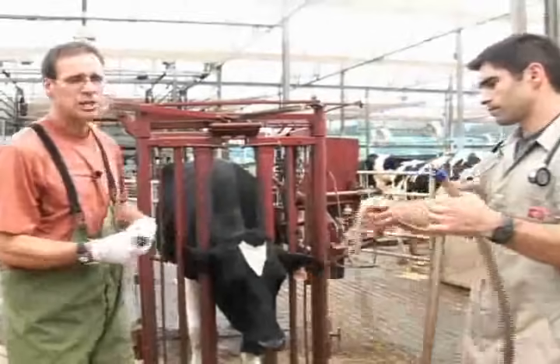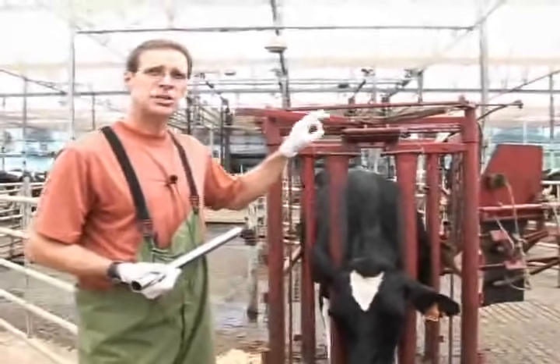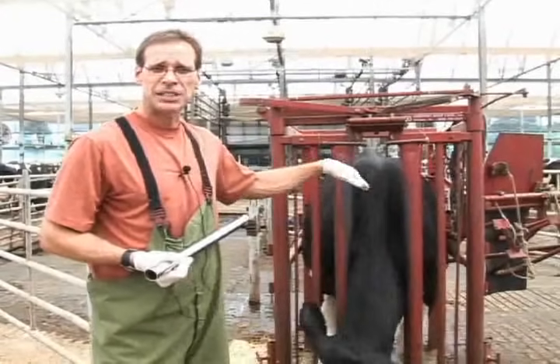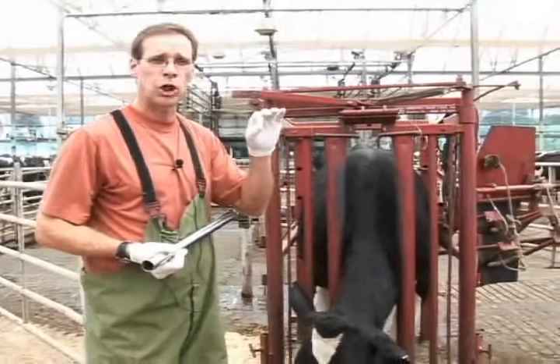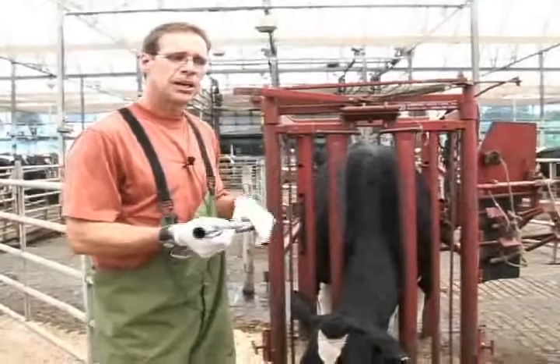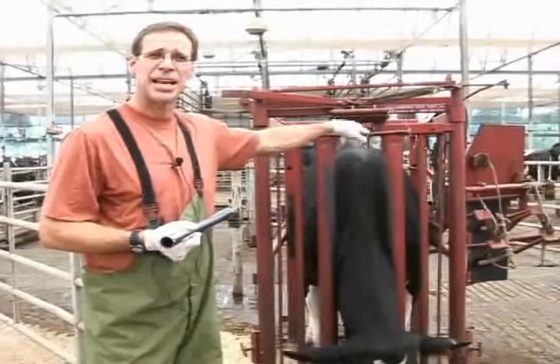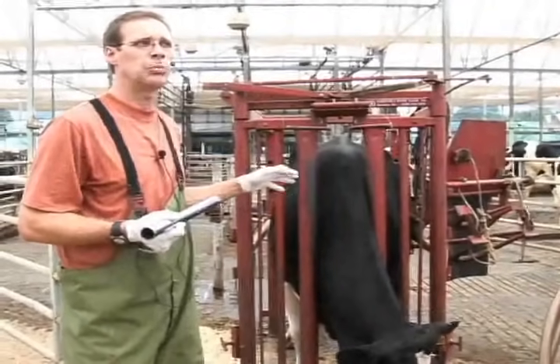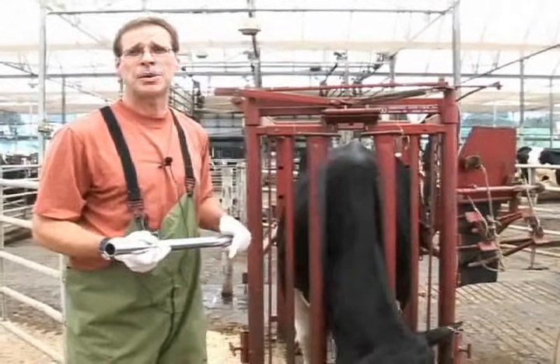With ruminants, you can also have an assistant use a stethoscope placed on the flank where the rumen is located on the left side of the cow. The stethoscope is used to pick up any airflow that a person may apply to the tube. Once the tube is placed, the person may blow into the tube and the person listening with the stethoscope over the rumen area may hear the air rush in. That is a very good checkpoint to determine that you're in the rumen.